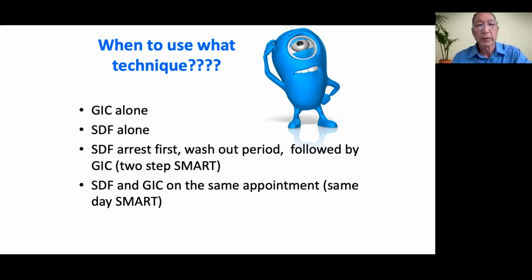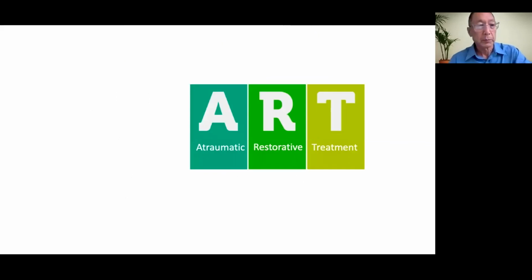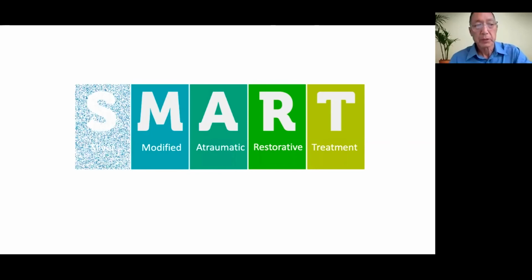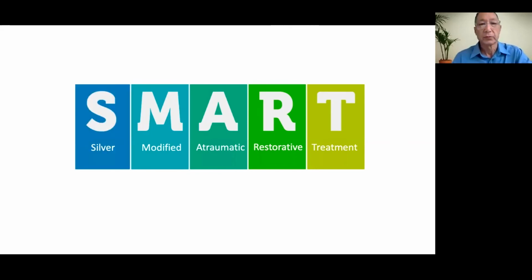And we're going to go over that now. SMART, by the way, stands for, you know what ART is, atraumatic restorative treatment. Well, SMART simply means modified to include, one, rotary instrumentation, whether it be a rotary handpiece or rotary hand drills, and two, the application of silver, in this case, silver diamine fluoride.